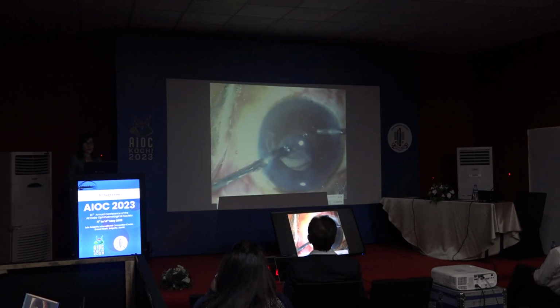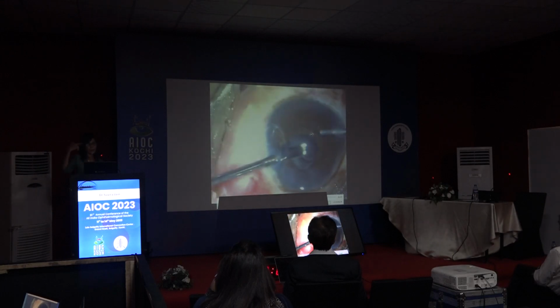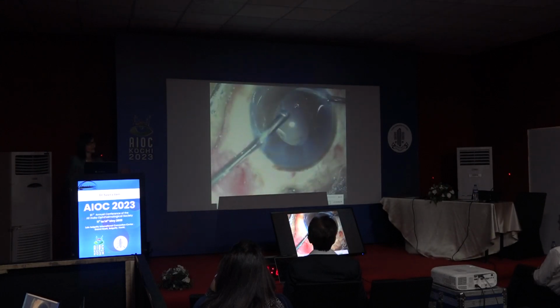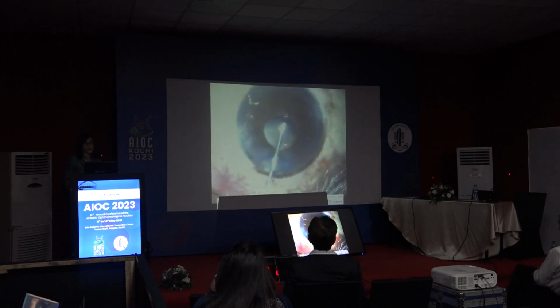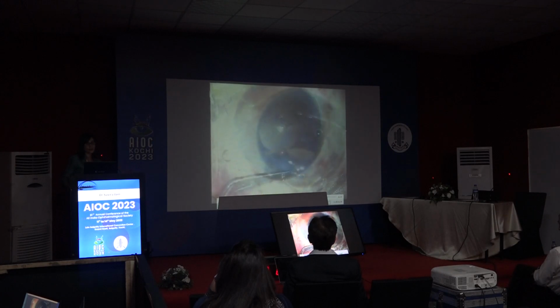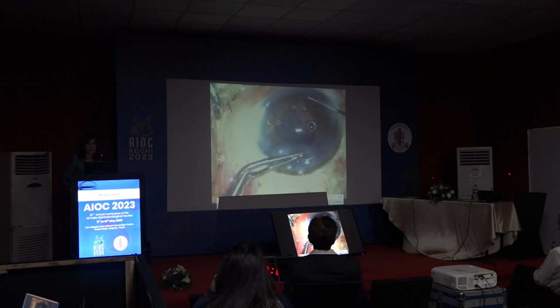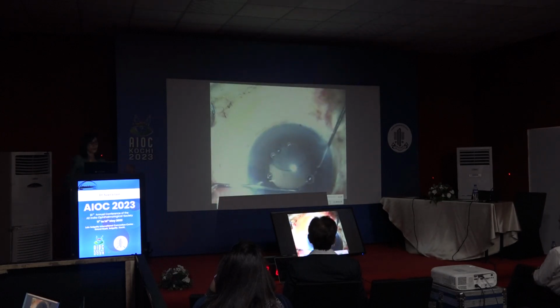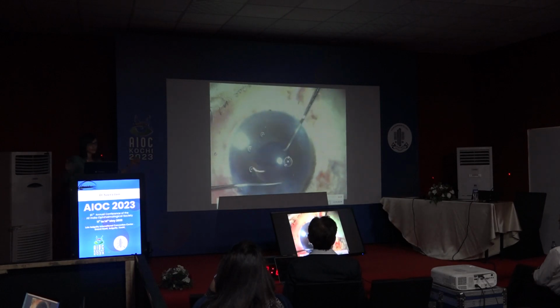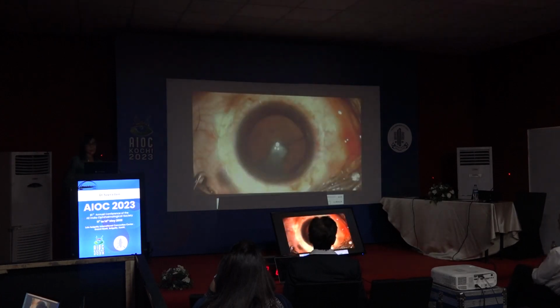Then, because there is a vitreous disturbance, I perform a limited anterior vitrectomy, and call on my VR colleagues. They're still very grateful if you do a good limited anterior vitrectomy, if you remove the cortex, and even more so if you place a three-piece IOL in. Here, I placed a rigid lens in the ciliary sulcus and suture the wounds before handing it over to them, so that then they can come in with their instruments, go in with pars plana, and remove the rest of the nucleus. I would always advocate doing this second surgery at the same sitting itself.